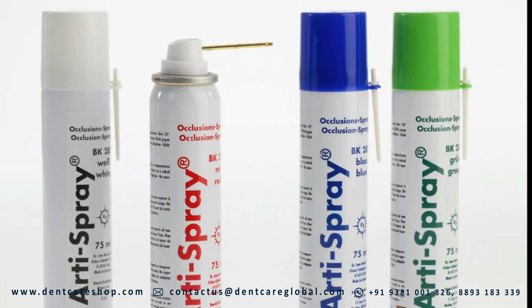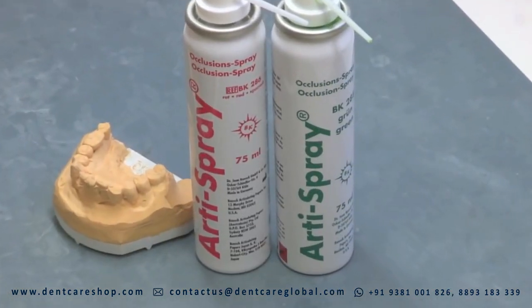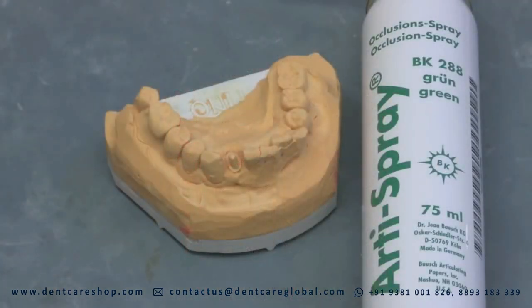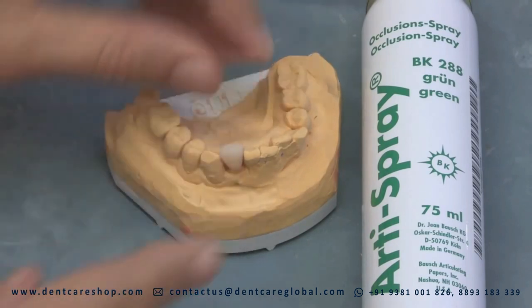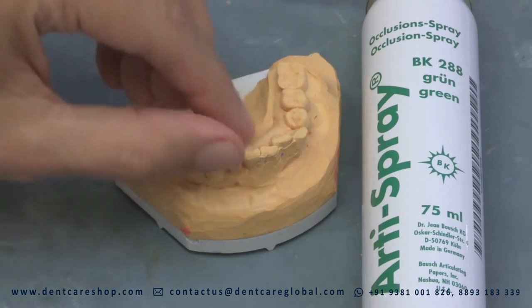Adi Spray is a universal color indicator to test the occlusal contacts and accuracy of fit of crowns and bridges. Adi Spray is easy to administer and leaves a thin colored film which can easily be removed with water, leaving no trace of residues.